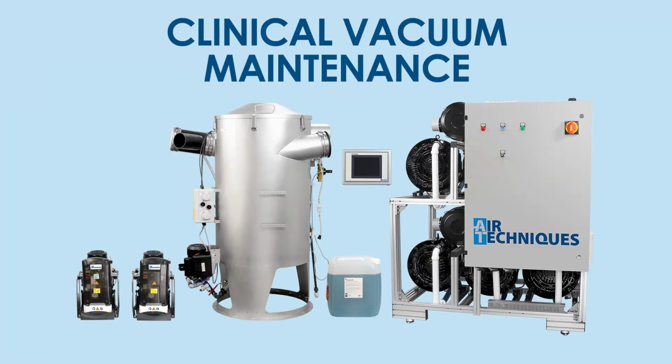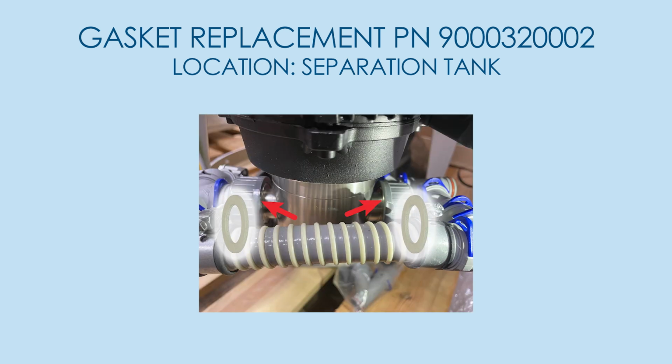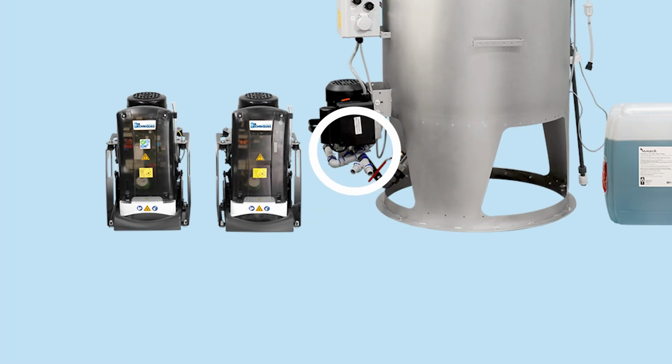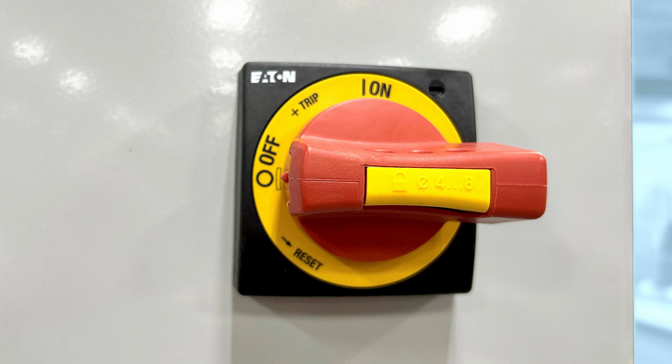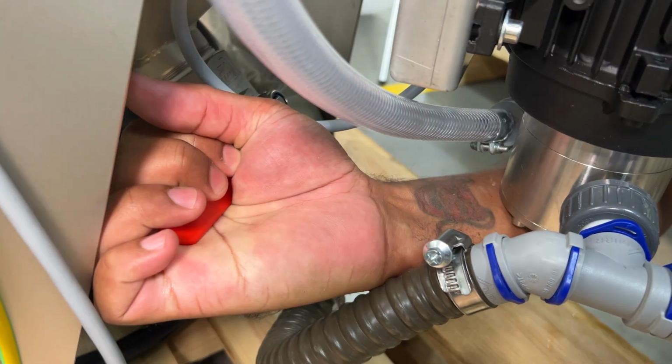In this video, we're going to be covering the gasket replacement, part number 9000320002 for the vacuum separation tank. To begin, locate the red knob and turn it to the off position. This will ensure the system is powered down. Shut off the drain valve on the separation tank.